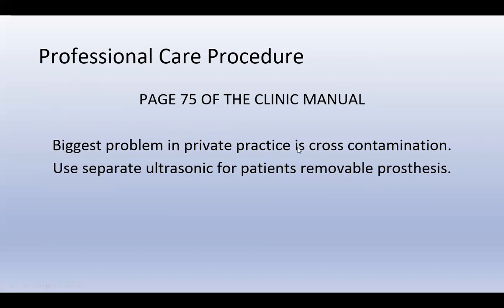The biggest problem in private practice is cross-contamination. Use a separate ultrasonic for patients' removable prostheses. There should be a small ultrasonic. They're not that expensive in the grand scheme of things, and it's only used for patient prostheses.